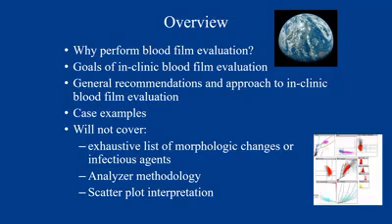What are we not going to cover? Well, first of all, I'm operating under the assumption that most of you guys have some degree of training, whether you're veterinarians or vet nurses, technicians, students, assistants, have probably all had some exposure to hematology. So this is not going to be so introductory that I'm reviewing what's a neutrophil, what's a lymphocyte, what's a CBC, things like that. I am expecting some operating working knowledge, just so it'll make this a little bit easier.